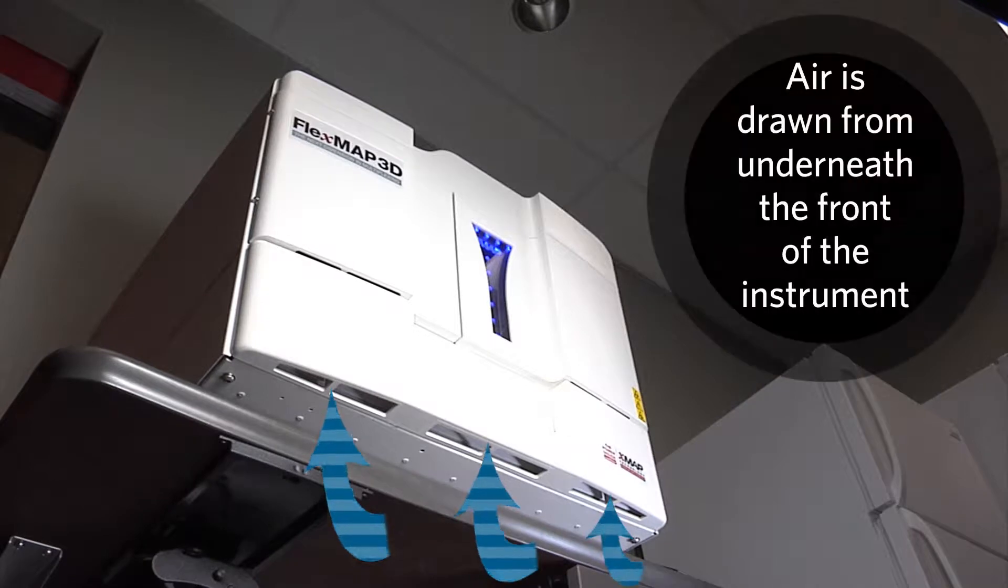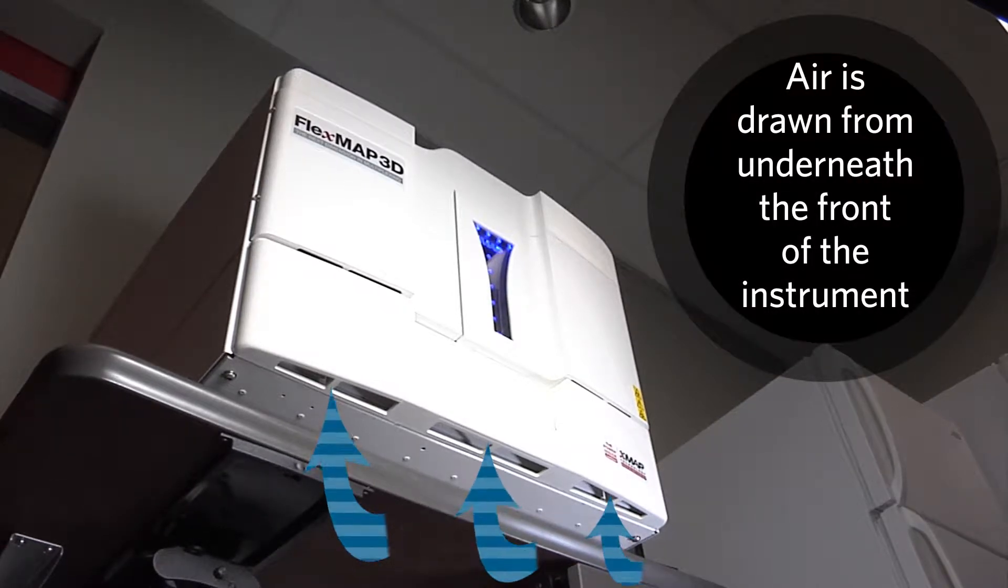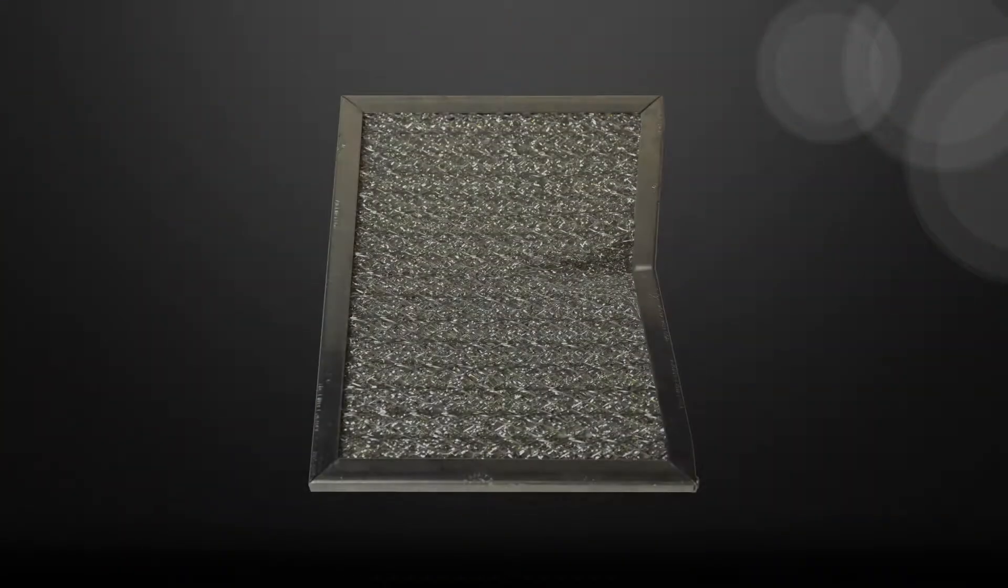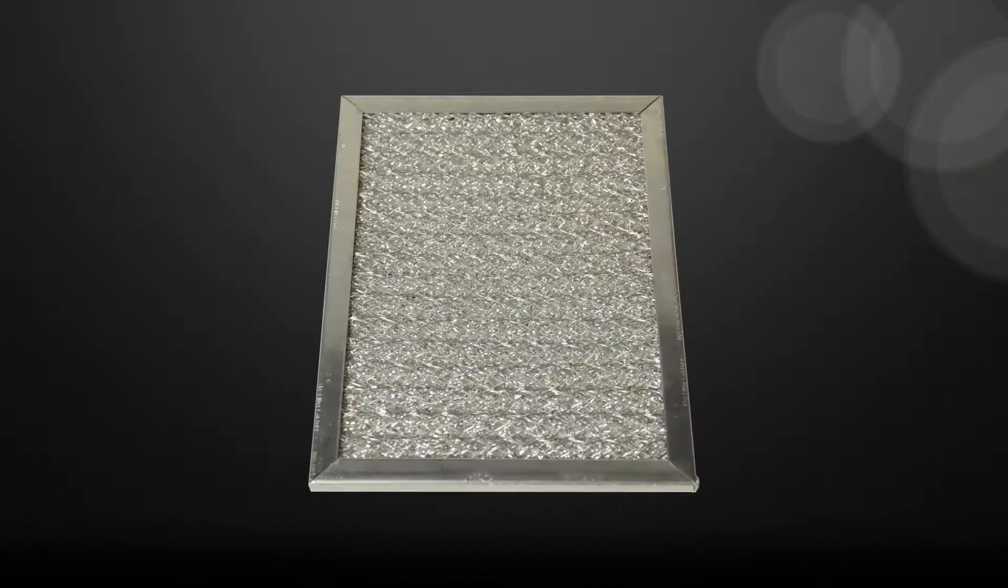The air is drawn from underneath the front of the FlexMap 3D through ventilation shafts that lead the air through the filters before going into the instrument. If damaged, the air ventilation filters may be replaced.